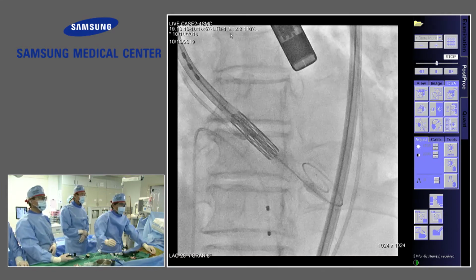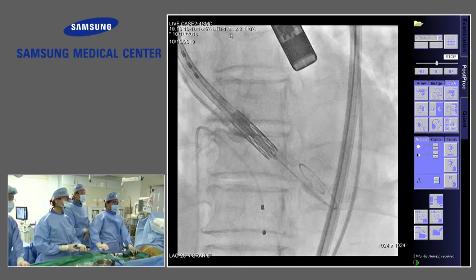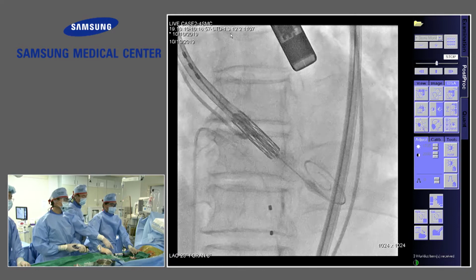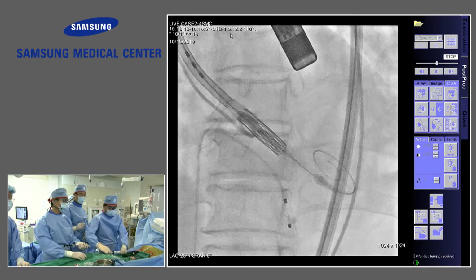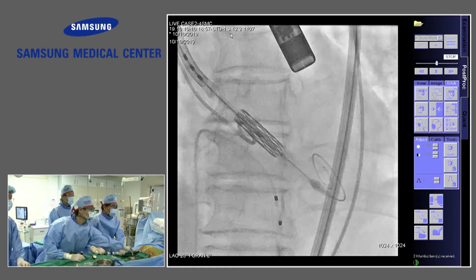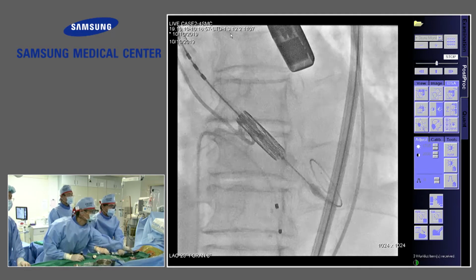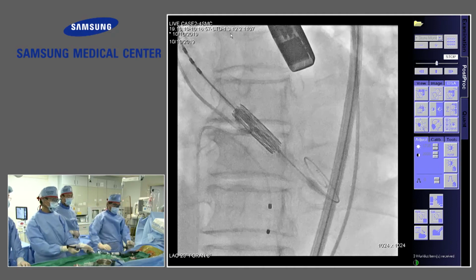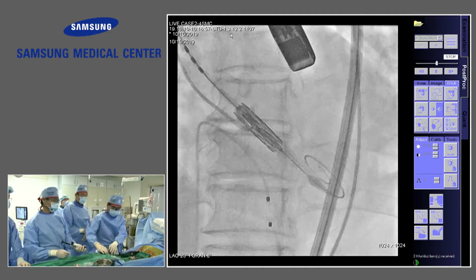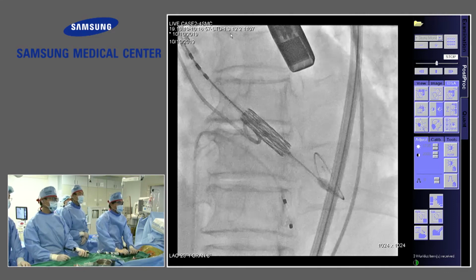You put it close to the coronaries, then you're just digging with the wire the entrance to the coronary, and then you push the guideliner and you're done. So it's going to be very easy with a self-expandable valve as well. But in this case, I think he's going to go for a good job and will be able to do it in the future. What size of it, the Sapien 3? 26, 2 cc on the field.